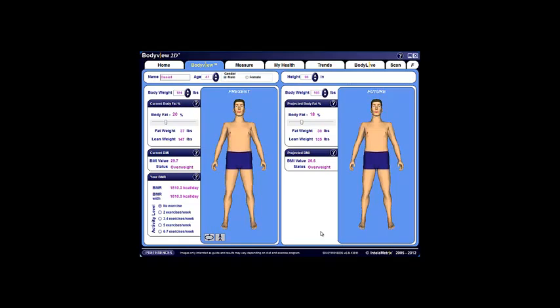Today we'll show you how to capture an image or cross-sectional picture using the scan feature. Scanning gives you the ability to target specific areas of interest and examine, quantify, and track both fat and muscle layer thicknesses. It's an excellent tool which validates the effectiveness of diet and exercise and provides tangible proof of change, showing evolution, progress, as well as regression.